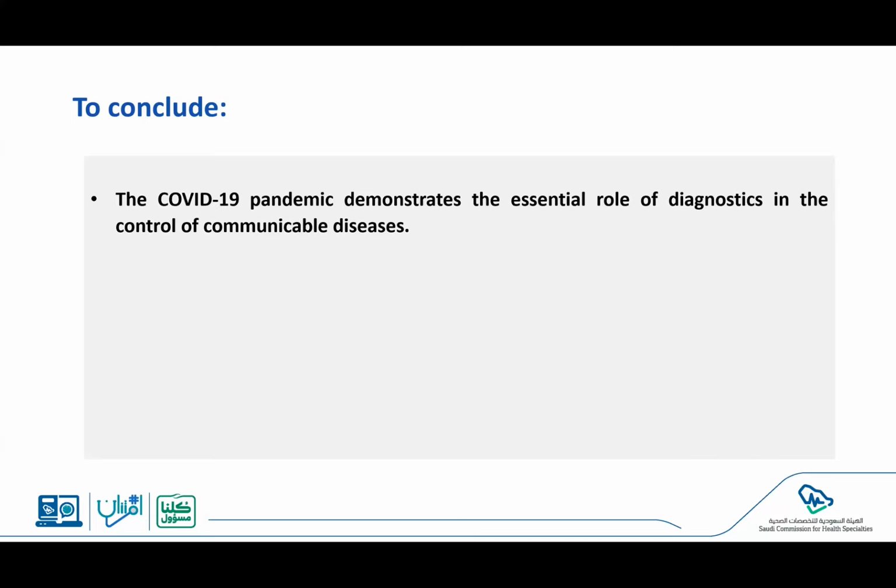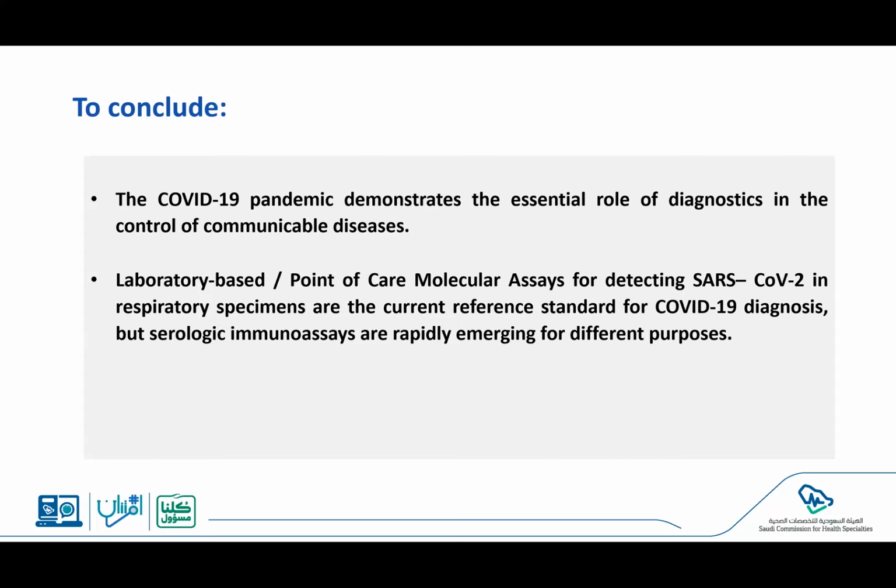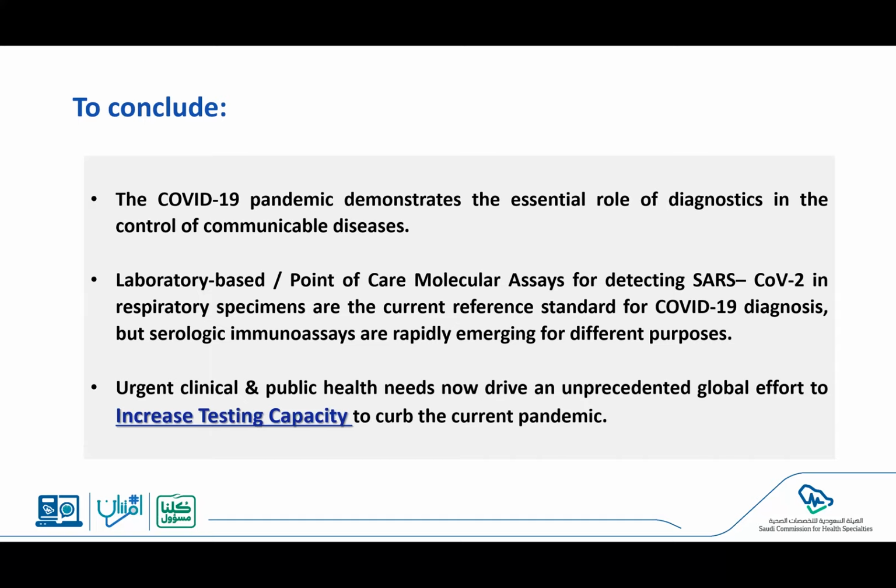To conclude, the COVID-19 pandemic demonstrates the essential role of diagnostics in the control of communicable diseases. Laboratory-based or point-of-care molecular assays for detecting SARS coronavirus 2 in respiratory specimens are the current reference standards for COVID-19 diagnosis. However, serological immunoassays are already emerging for different purposes. And urgent clinical and public health needs now drive unprecedented global efforts to increase testing capacity to curb the current pandemic. Thank you.